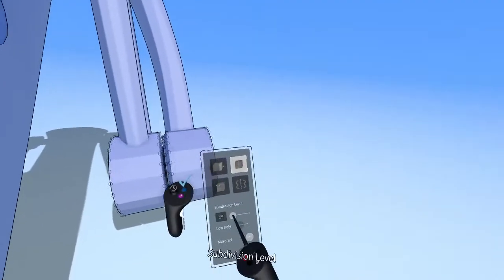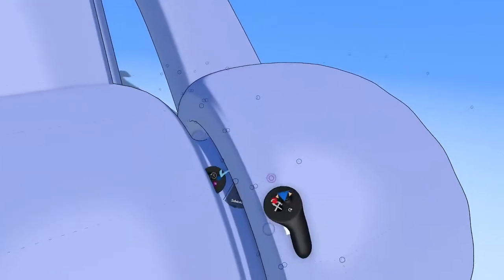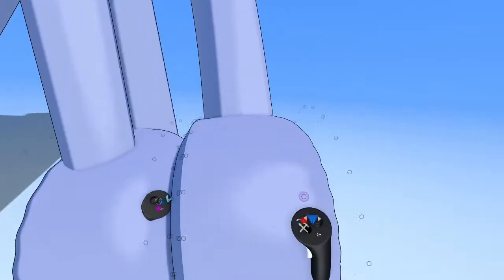Yeah, I'll just leave that. All right, turn on Subdivision and click in some extra edit points here.